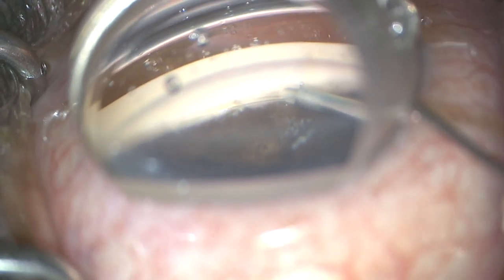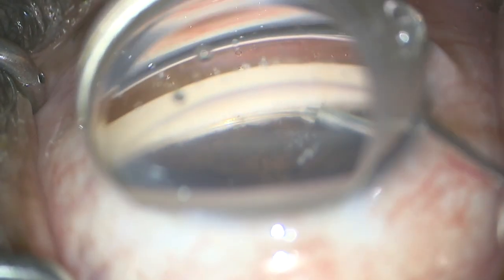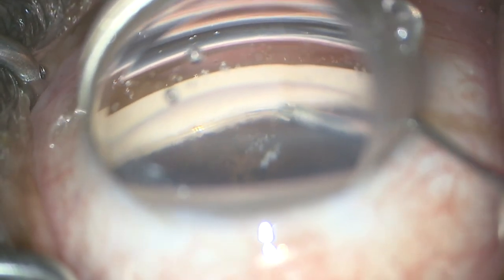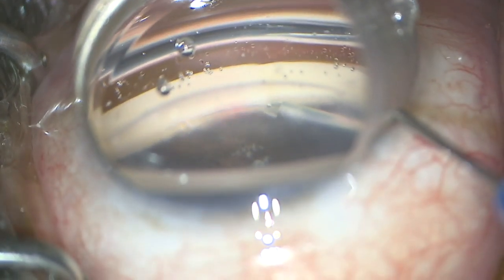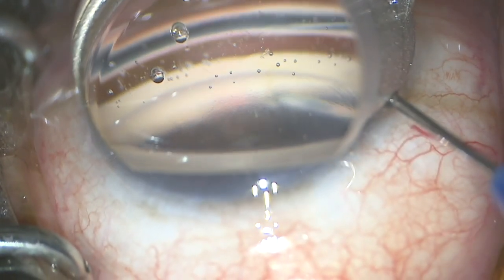As the catheter is advanced all the way around, the viscoinjector is clicked 3 times per clock hour, dispensing 2 to 3 microliters of Healon Pro each time, performing a pressurized canaloplasty. Blanching of the episcleral veins can be seen, and the microscope is focused up to highlight the blanching.